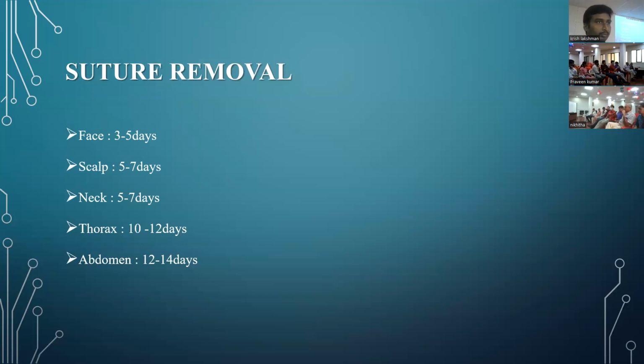And sir, let us just clarify this. Alternate suturing, do you follow that? I don't see there is any advantage. There are surgeons who follow it, and if you are working for them, you follow whatever they say, but there is no advantage.